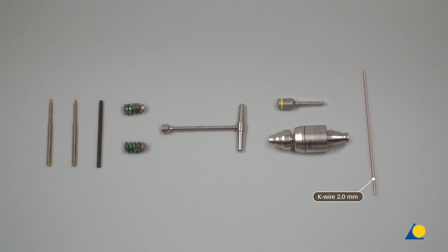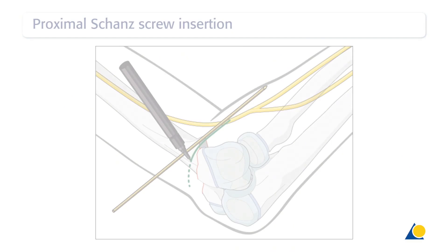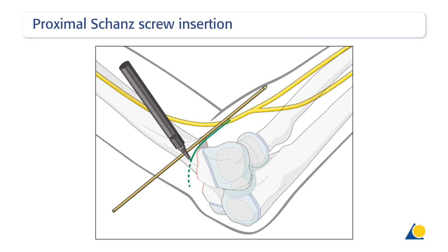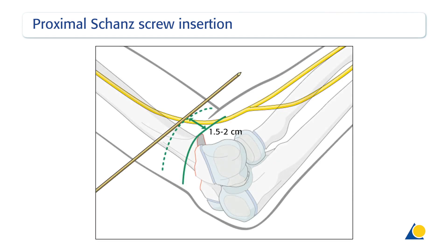A 2.0 mm K-wire will be used to prevent rotation of the distal fragment at the fracture site. In a clinical situation, the proximal fracture level is identified under image intensification with the help of a K-wire. Using this line for reference, the safe level for screw insertion is 1.5 to 2 cm proximal to the fracture level; more proximal insertion can damage the radial nerve.